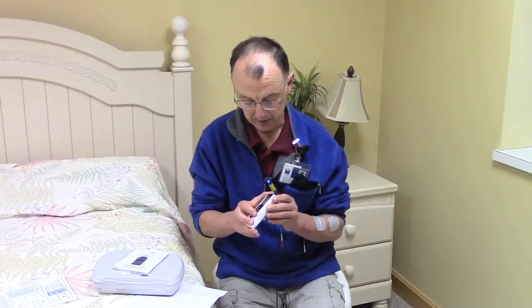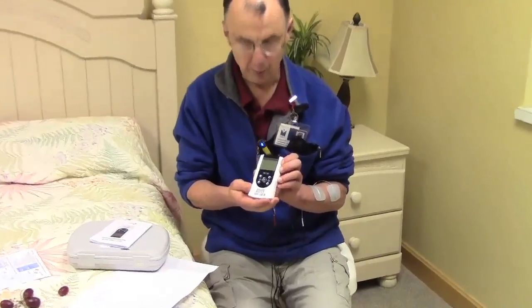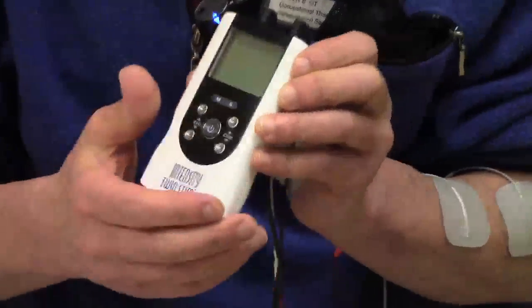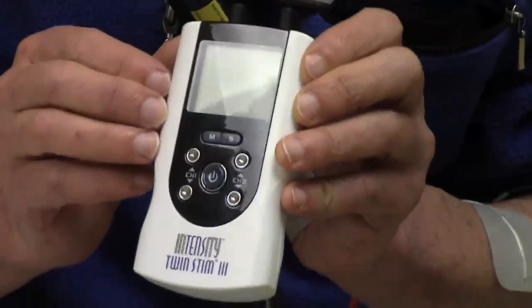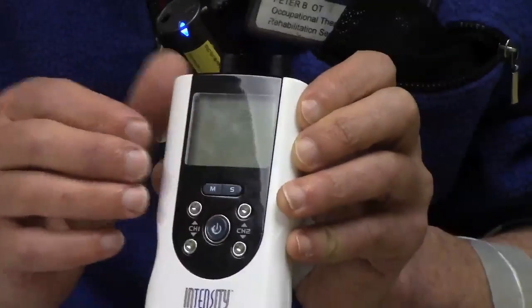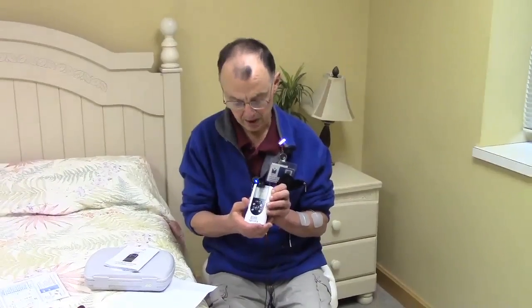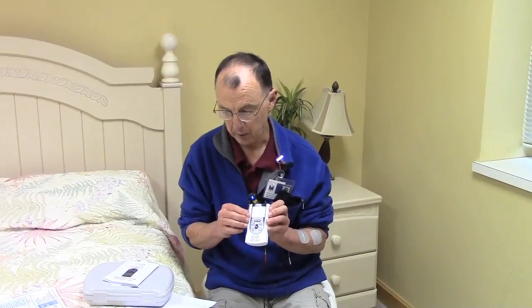The device I'm going to be using today is the Twin Stim 3, which is not very expensive and you can find it online. Our patients have found this to be helpful and several will buy one. Usually insurance doesn't pay for it, but they'll buy one, get some instructions from the therapist, and be able to use it at home. So I'm going to walk through how to program this and show you how it all works.